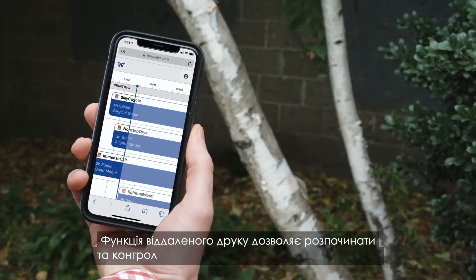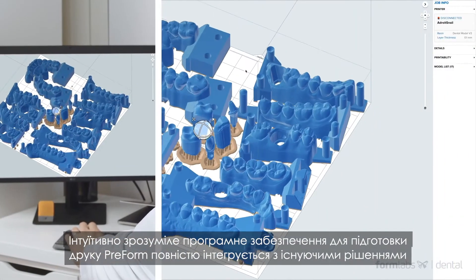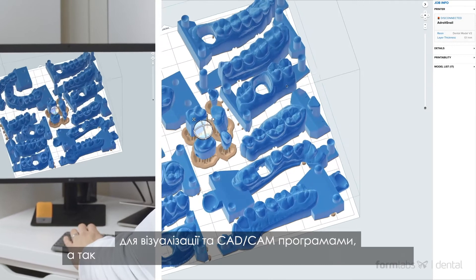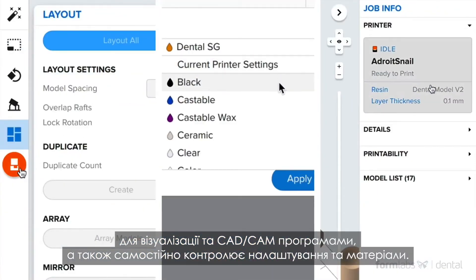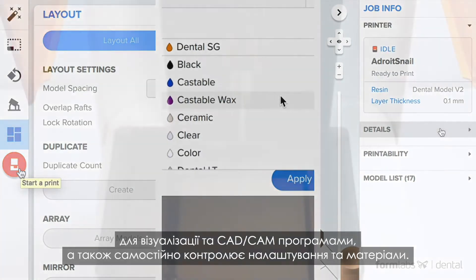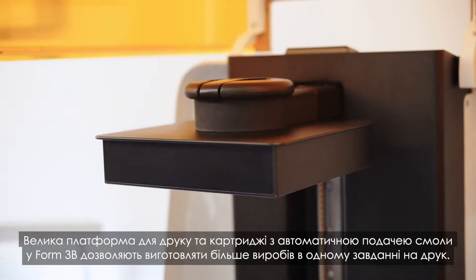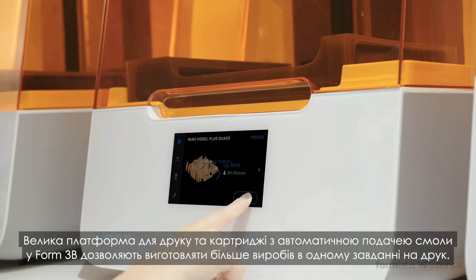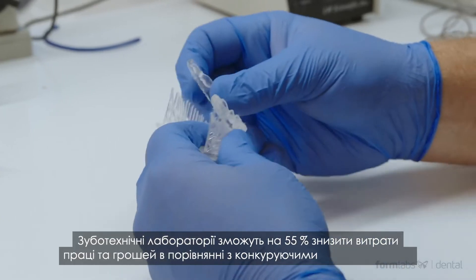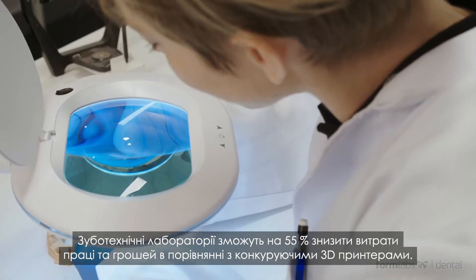Remote print allows you to initiate and monitor prints from anywhere. With user-friendly PreForm print preparation software that integrates seamlessly with existing imaging and CAD-CAM solutions and full independent control over settings and materials, the Form 3B's large build platform and automatic resin dispensing material cartridges allow for more parts per print job. Dental labs can expect to see 55% less labor and costs compared to competitive 3D printers.